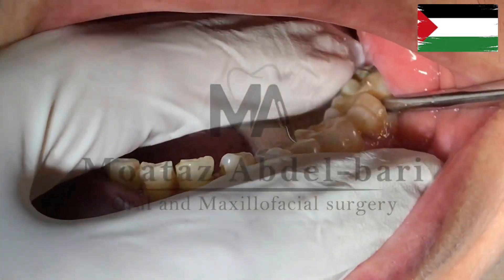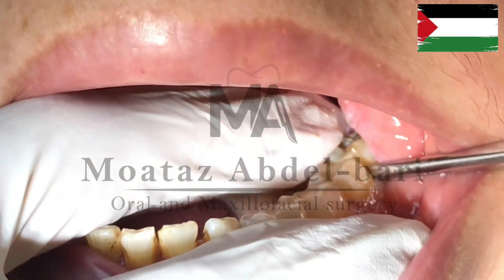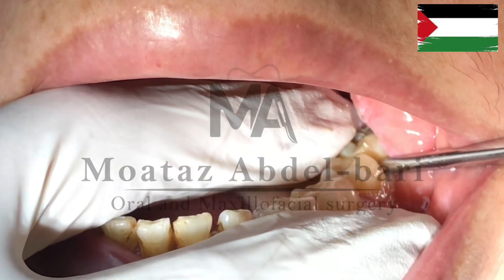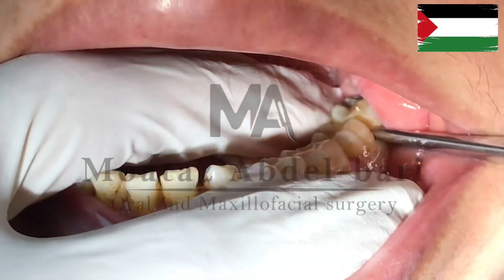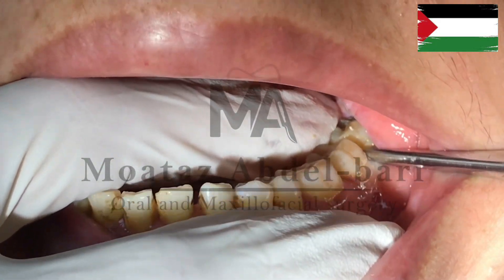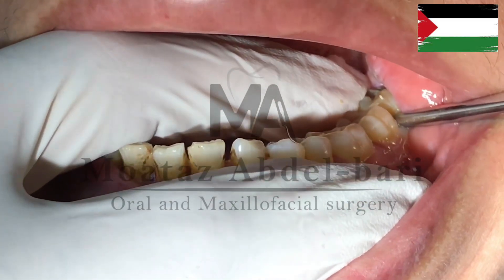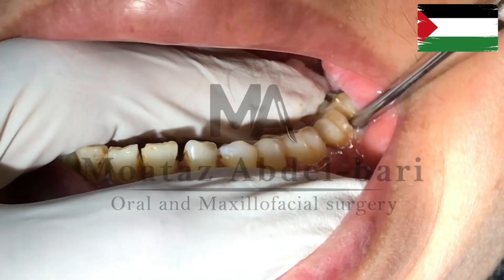Considering the potential for multi-rooting, place the middle finger of your non-dominant hand on the occlusal surface of the tooth to assess the maximum range of luxation. Pay attention to any resistance felt during elevator movement — you must stop at this moment and use forceps.